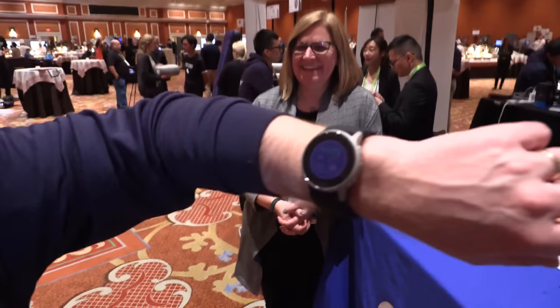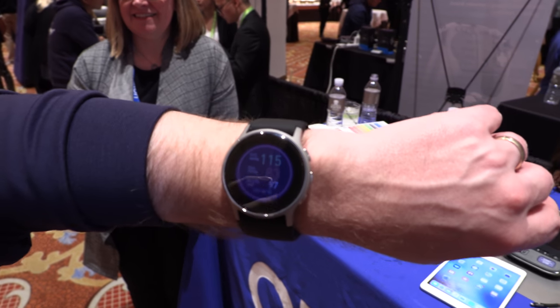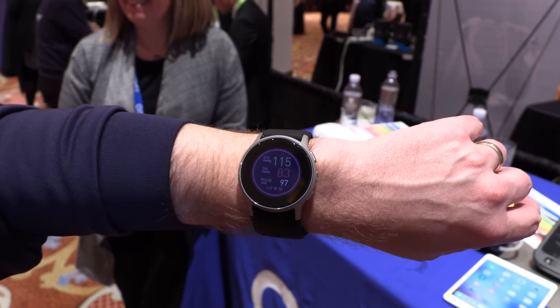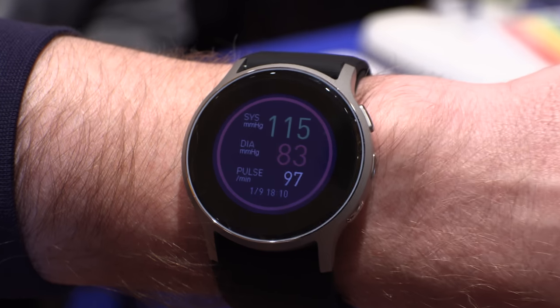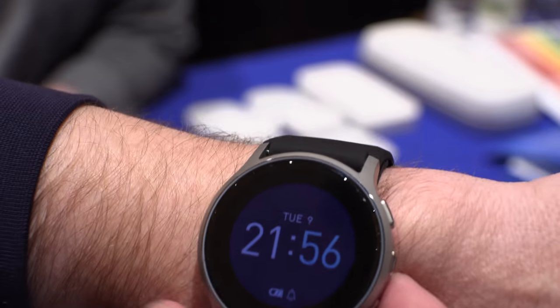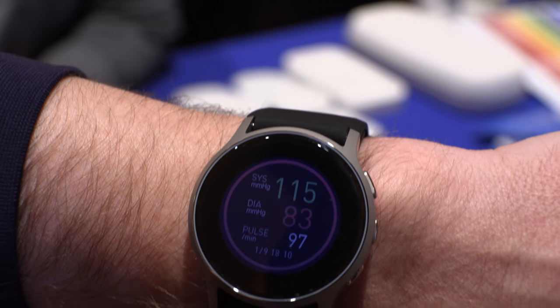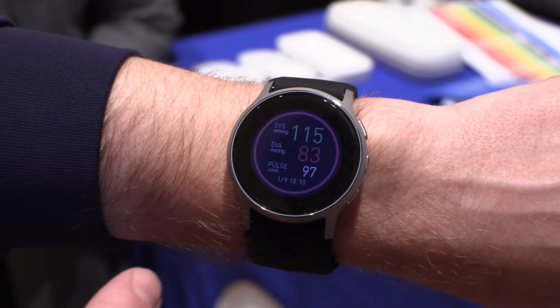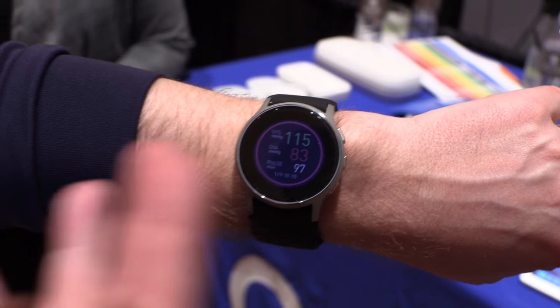Was that a good number you just got? Well, let's take a look. It told me it was 115 over 83. You'll notice they're color-coded. The 115 means that's good — that's my systolic, when my heart is actually contracting. My diastolic, the lower number, is when my heart is at rest, and that should be below 80. So because it's higher, it's red.